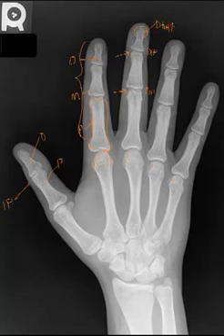The differential diagnosis is quite long, and once we get into differential possibilities, we'll talk a little bit more about that. These are sesamoid bones, these little small bones that you can see both in the hands and feet. Again, sesamoids are within tendinous structures and typically occur at the fulcrum of a joint.